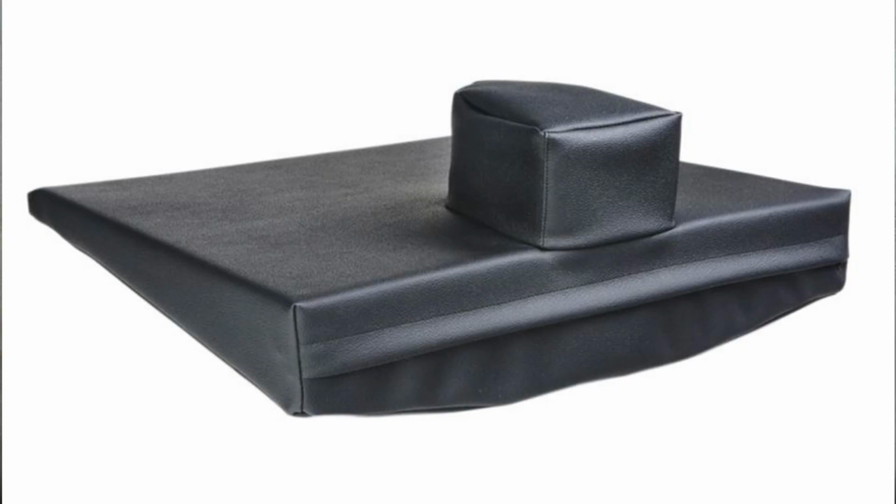Well, if your chair no longer has that adjustment to get where you want it to go, then you could add a wedge underneath a cushion. The next one is kind of hard to describe, so I'll show you here. It's called a pommel. And if you see here, it's just like a foam pad that goes between the knees and the front of the seat.